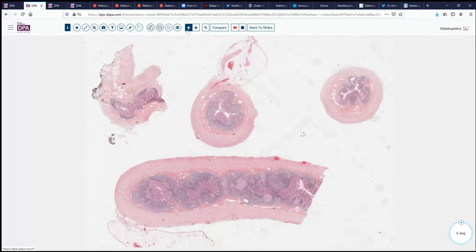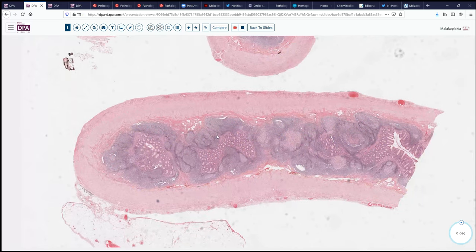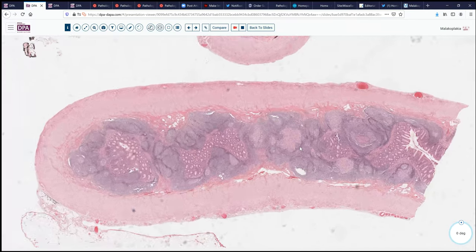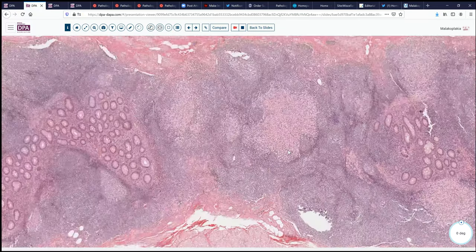When we look at the appendix under the microscope, we see the inked section showing the resection margin, some full thickness transverse sections, and then the appendiceal tip. The appendix is not dilated and there's no evidence of increased inflammation or serositis on the serosal surfaces. But what we do see in the distal tip are a couple of pale areas that look a little different than the usual germinal centers. We're going to take a look at these more pale areas to see what may be going on within the lymphoid population.